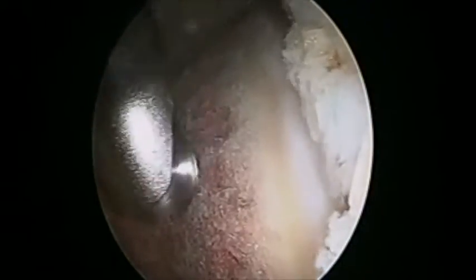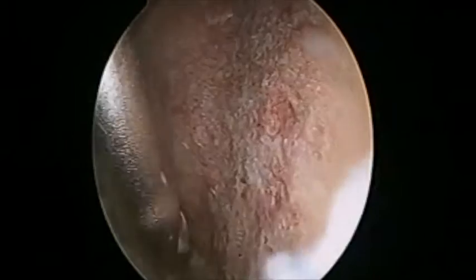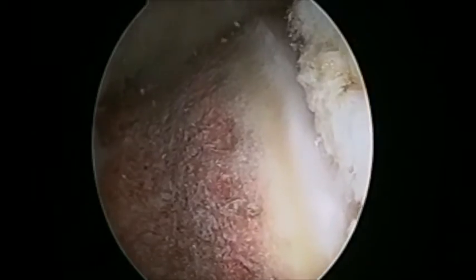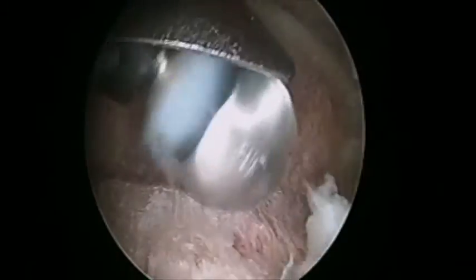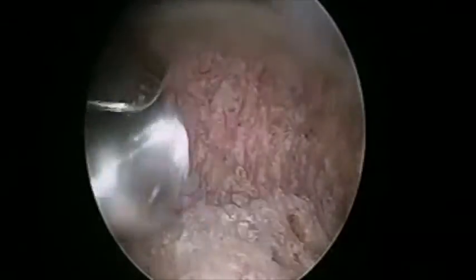This portion of the video demonstrates another critical concept for this technique, which is the importance of visualization of the osteoplasty in multiple views, which allows for optimal resection and contouring. Here we demonstrate another view frequently utilized by the senior author, deemed the up the neck view, in which the arthroscope is rotated 90 degrees to look directly up the neck at the head-neck junction. This allows yet another perspective of the proximal resection in order to ensure a smooth transition is created along with the spherical head.